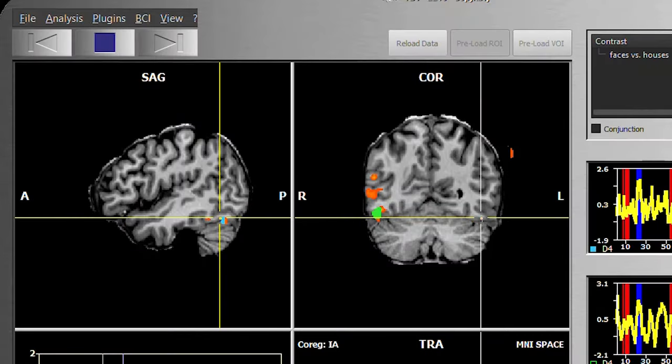Can you imagine peeking into someone's brain to decode what they are thinking or dreaming about? Scientists in the field are using fMRI together with powerful new advances in artificial intelligence to take a snapshot of the brain. These snapshots help us understand how and what things people pay attention to. We want to pinpoint what the participant is paying attention to by visualizing metabolic activity in the brain using fMRI.